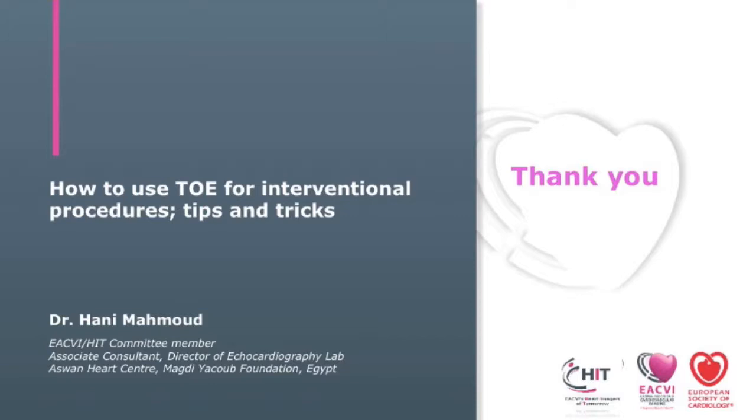Diagnostic echo is not all that you need in interventional echocardiography, and my feeling is that we need specific education for the interventional echocardiographer and interventional imager. How many procedures should you have guided or seen in order to become competent in performing echo during TAVR procedures, Hani?